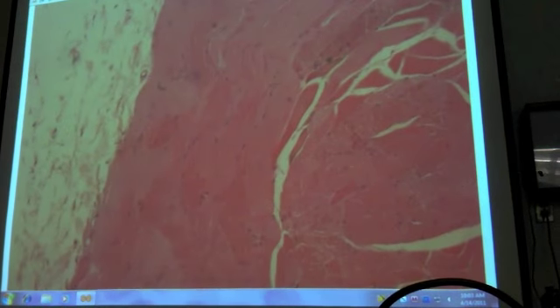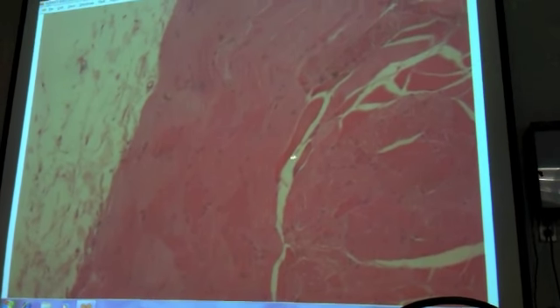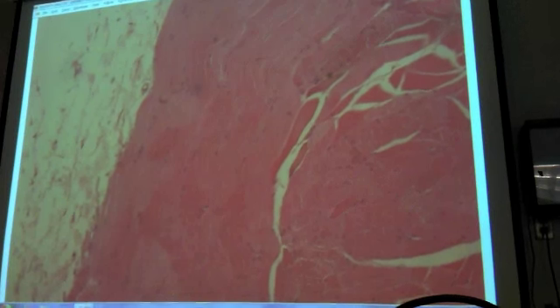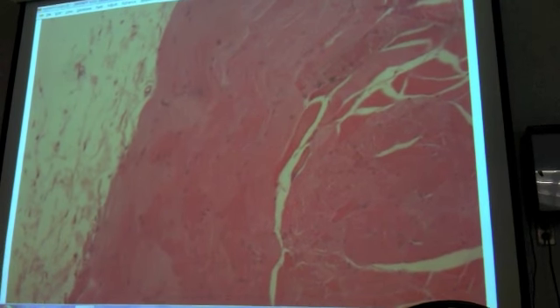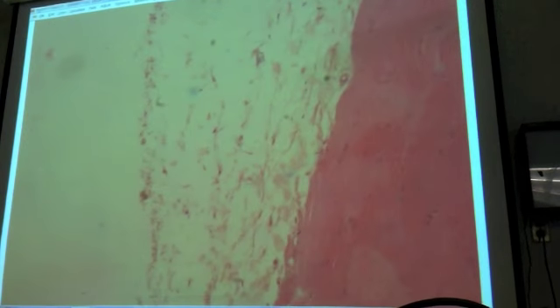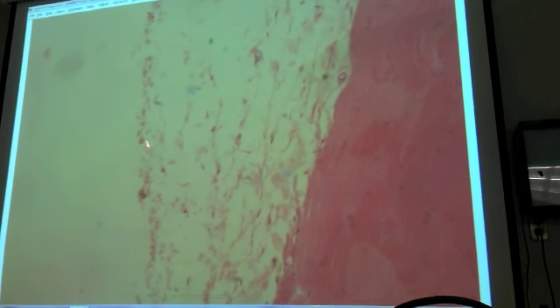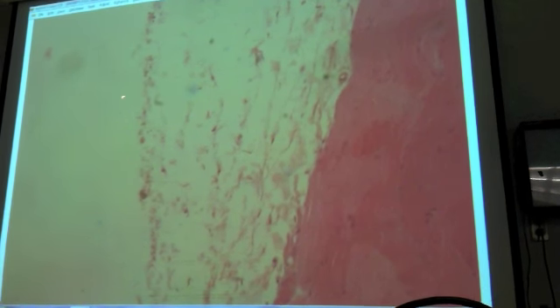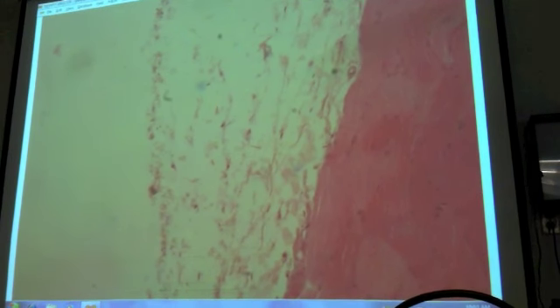And we do have a differentiation between one muscle layer and another one here. It's not as discrete as we're gonna see later on. So I'll talk more about that, but I probably wouldn't ask you circular versus longitudinal layer here, but we do see where that transition is. And we get external, and we just have some fibrous connective tissue which has been disrupted. So it's been pulled apart, looks loose, but it was really very fibrous, but there's no epithelial edge. So this is adventitia, okay?